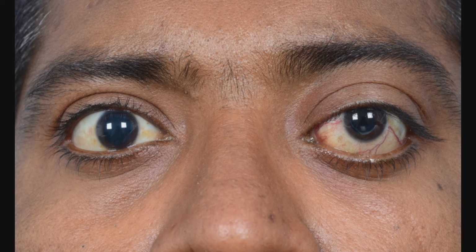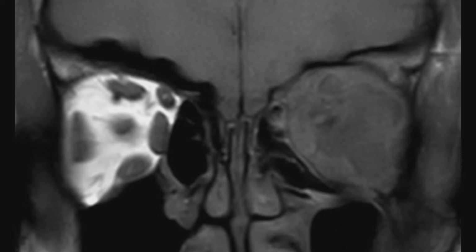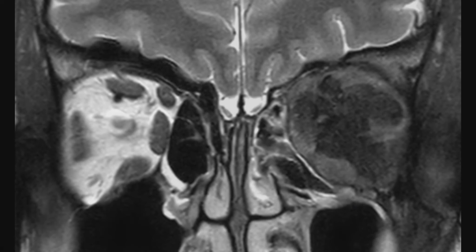Here is a 34-year-old male with only light perception in the left eye, axial proptosis, restriction of ocular movements in all gazes, retrobulbar resistance, a palpable firm tender mass inferomedially and choroidal folds. MRI showed an ill-defined lesion, hypointense on T2 and iso to hypointense on T1 in the intraconal plane with focal extension into the extraconal plane along the superolateral and inferolateral aspects.